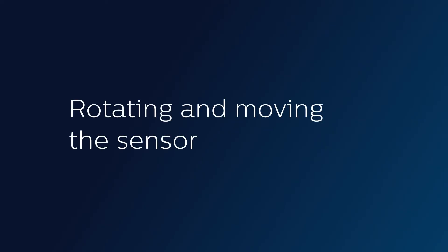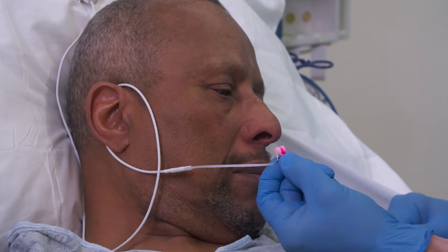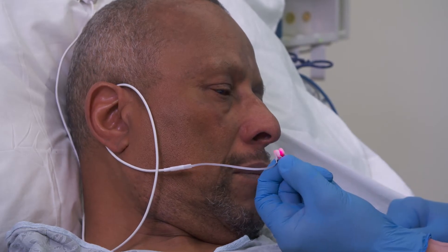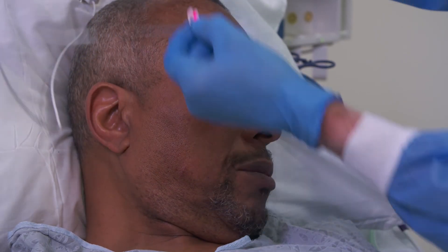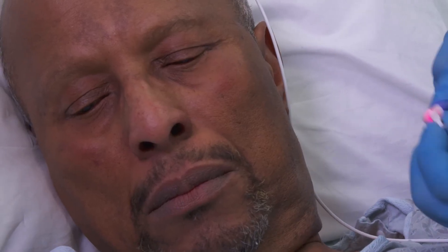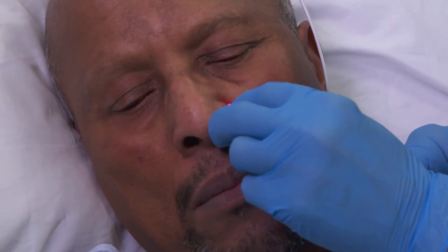We like to rotate these sensors periodically so we don't get a pressure injury. It removes very smoothly because it's silicone — there's no adhesive. To go to the other side for site rotation, we just turn the head, rotate the probe to keep the light to the outside, and slide it right in.